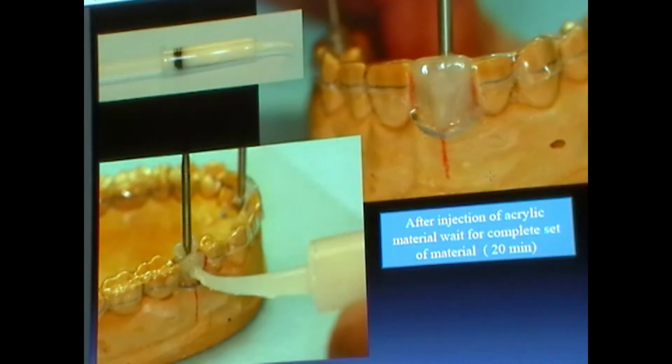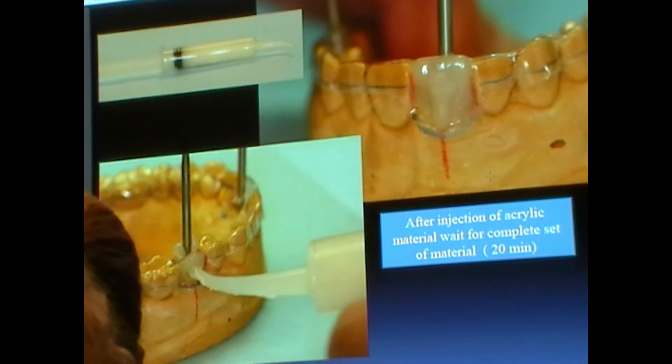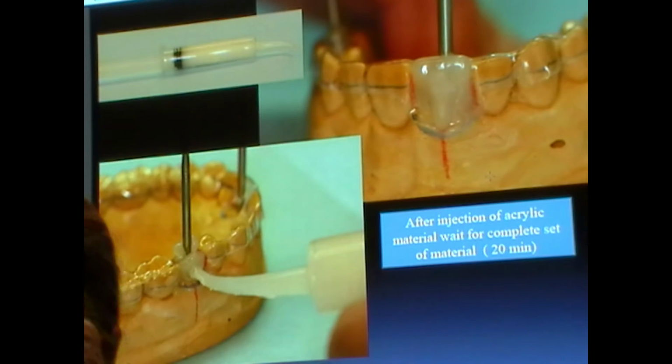If you don't do that, then it's going to stay, and then it's kind of a challenge trying to get that out. So that's going to stay in the incisal portion of your template material, and you're going to syringe material within so that it exudes out. You should see some express onto your cast. So it shouldn't be all on the tabletop or in the palette, but just a little bit, okay?